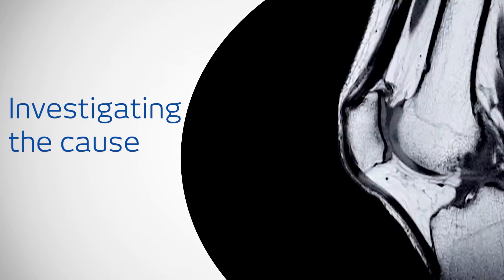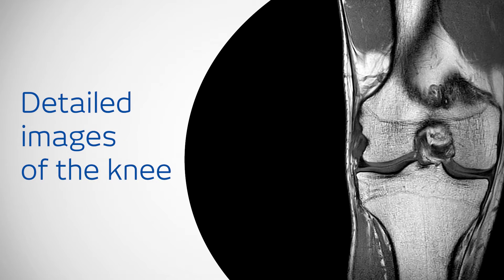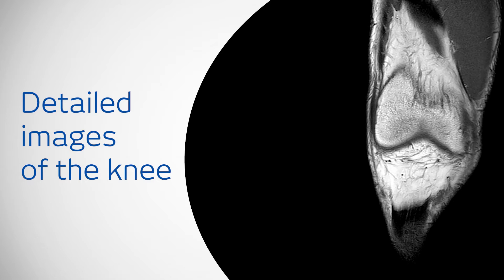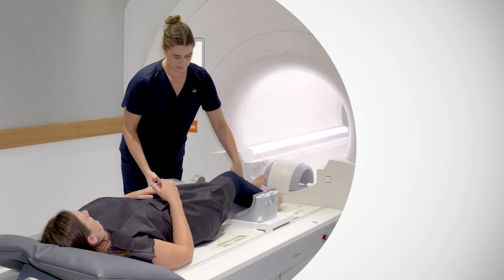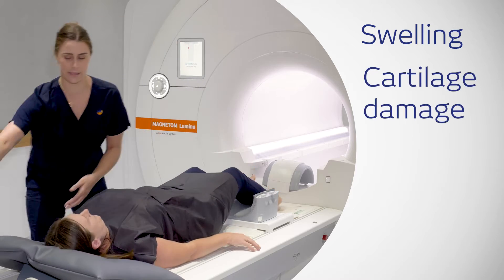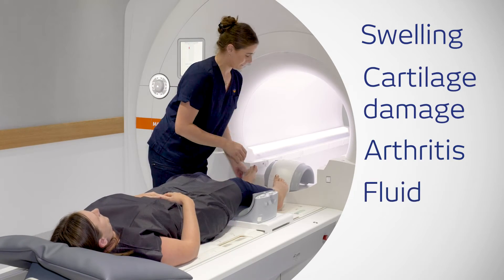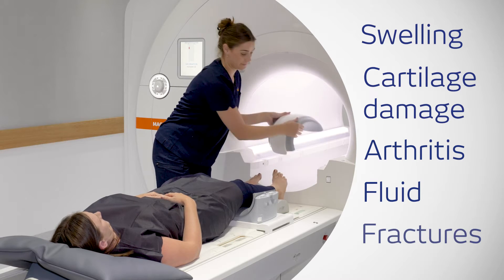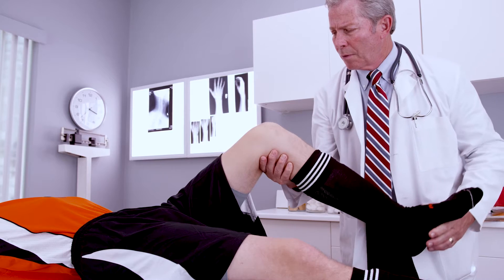MRI uses strong magnetic fields to produce detailed images of the knee, including bone and soft tissue. It can identify swelling, damaged cartilage, arthritis, fluid buildup, and bone fractures not visible on other imaging tests.